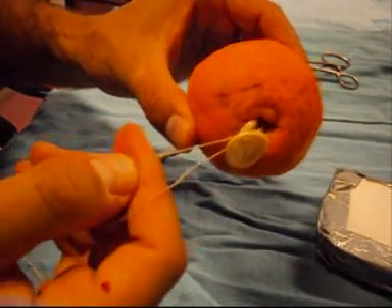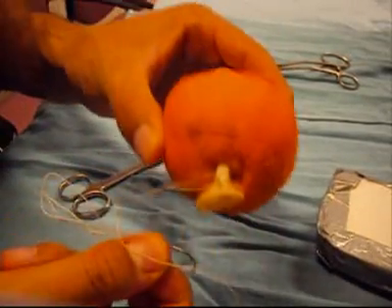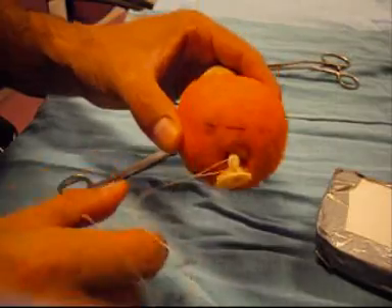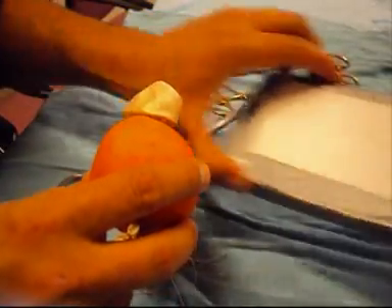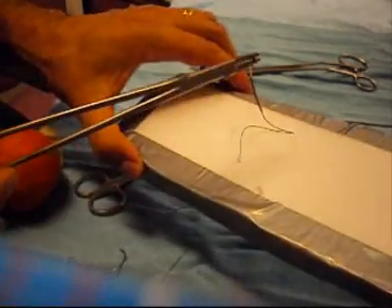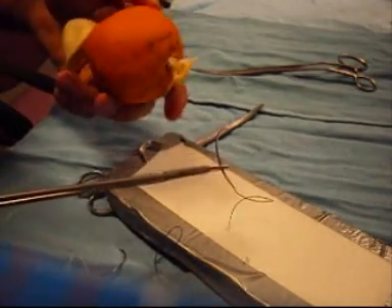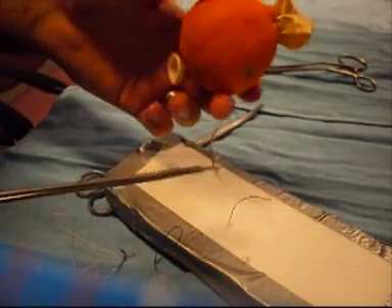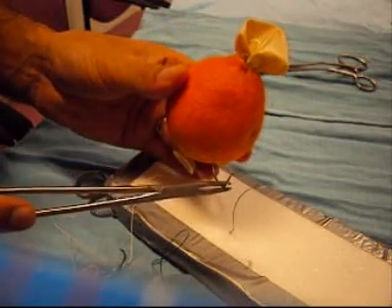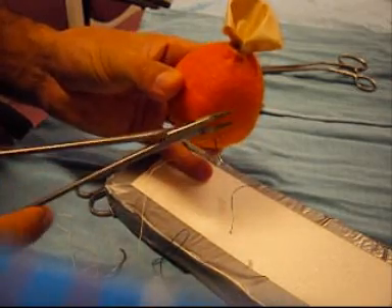Suture is then tied to the neck of the balloon, and the free needle is left, as this will be used to help fixate the model to the foam or cardboard shortly thereafter. Heavy suture is then passed through the foam and will now be passed through the base of the prostate — in this case just through the skin — as this is ideal for fixing the prostate to the model.